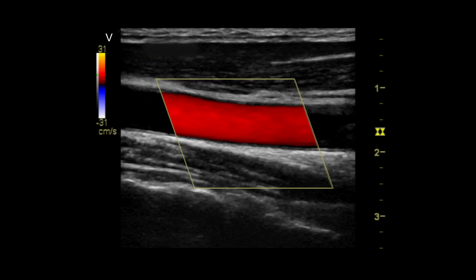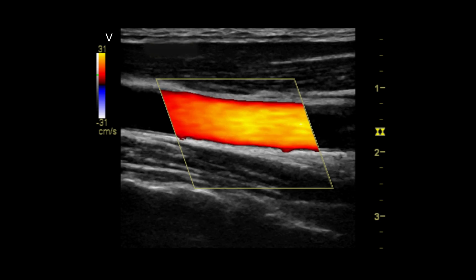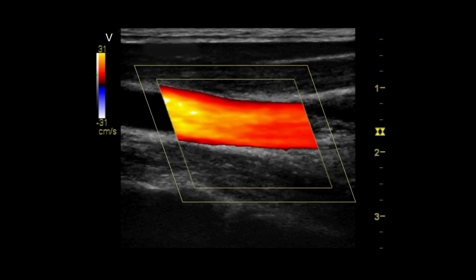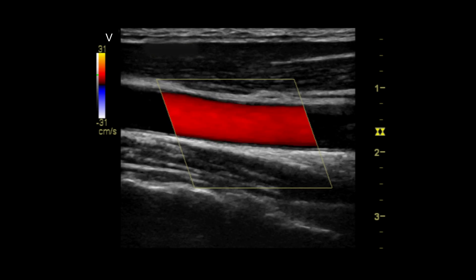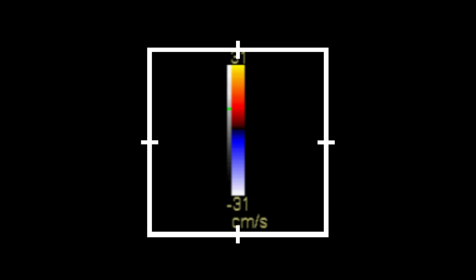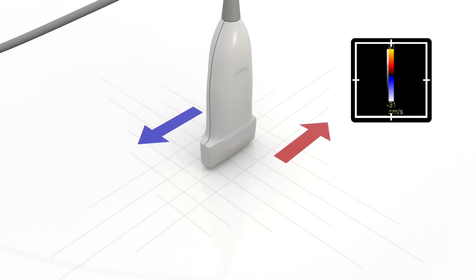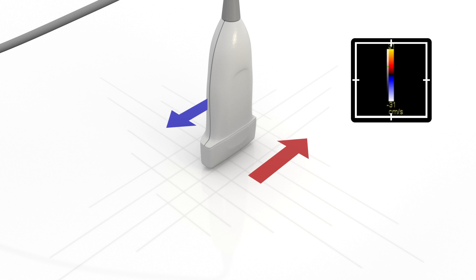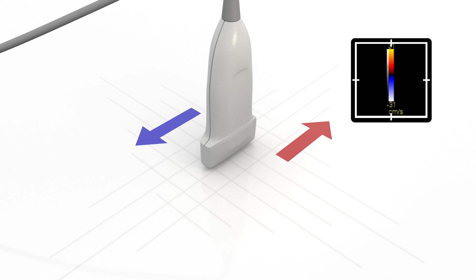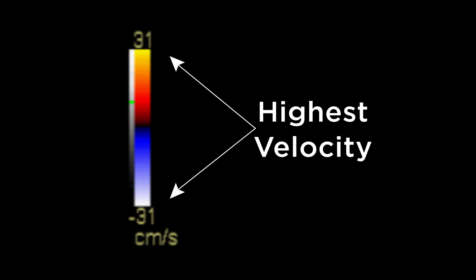Activate colored Doppler on the device and position the color box over the lumen of the common carotid artery, or CCA. The color bar serves as a legend that maps color to the velocity and direction of blood flow. The red color indicates flow toward the transducer, and the blue color indicates flow away from the transducer. The intensity or brightness of a color is a representation of the velocity of flow.